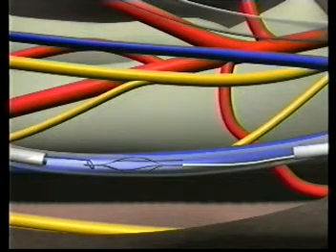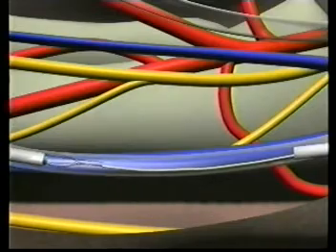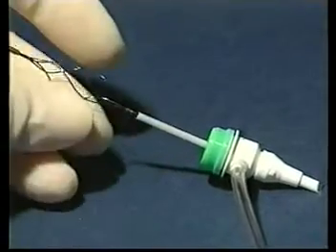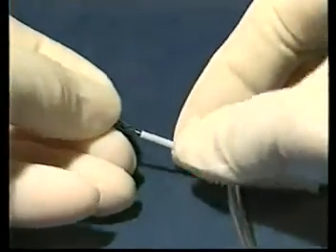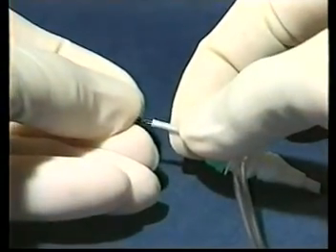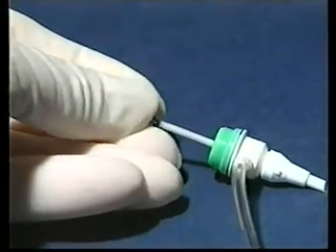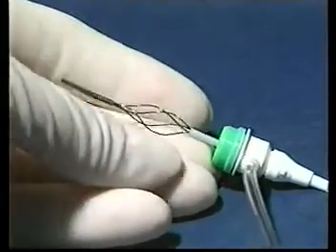In order to remove a device in this situation, approach the basket through the opposite sheath. Using a snare, grasp the tip of the basket, pull the basket out through the opposing sheath, and it should come out easily because the wire will be facing in the correct direction. At this point, one can manually guide the wire into the catheter and pull the device back through both sheaths and discard the damaged device.